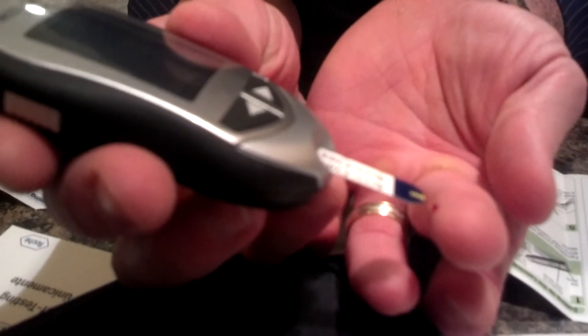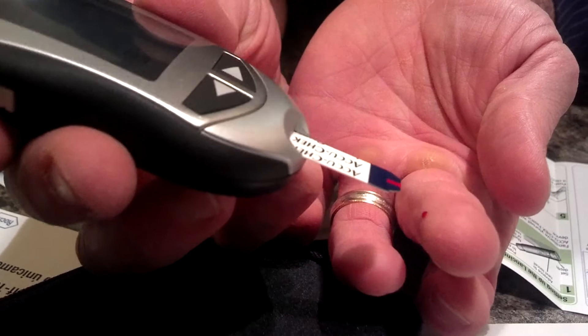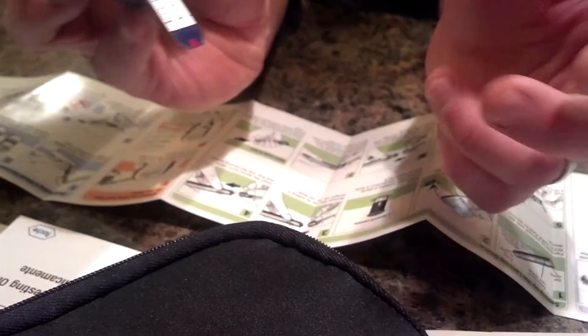Now I just touch that right on the end. Whoa, that's pretty cool. Now in like five seconds it's going to give a reading. Are you seeing the video okay?